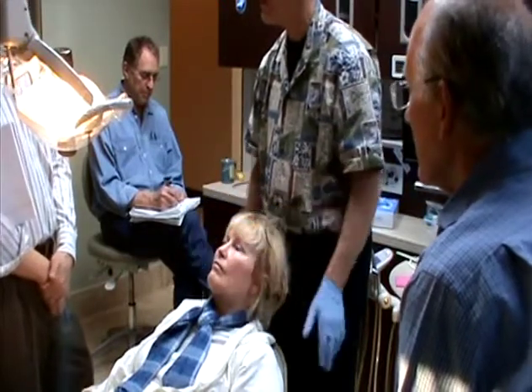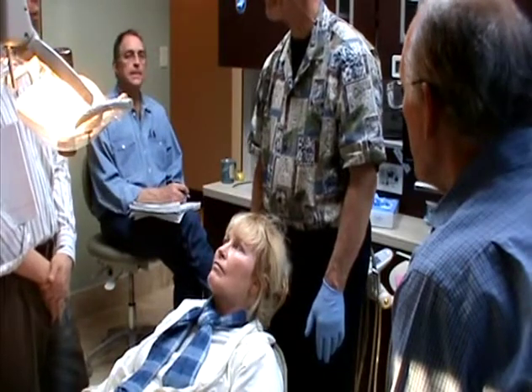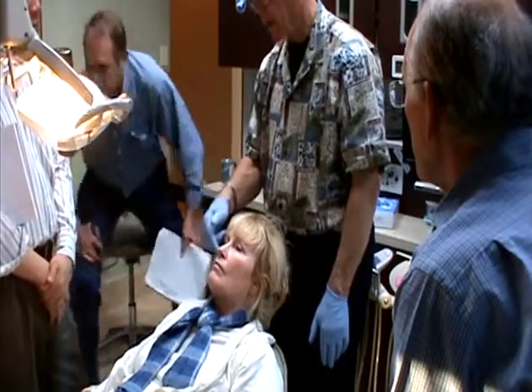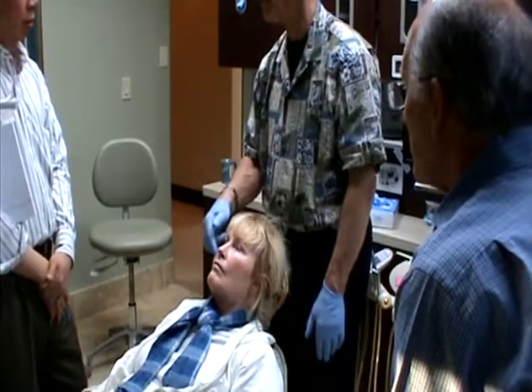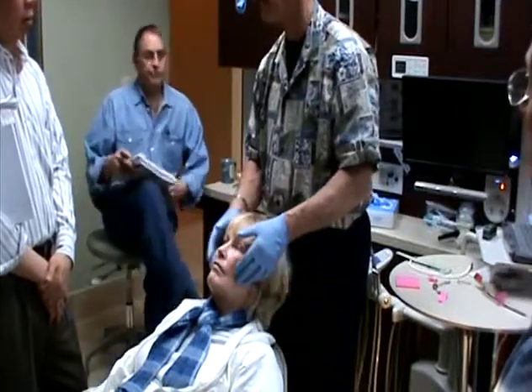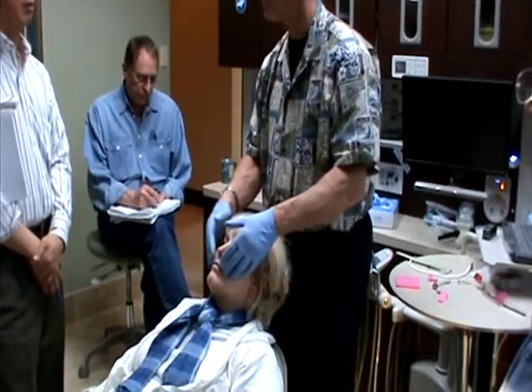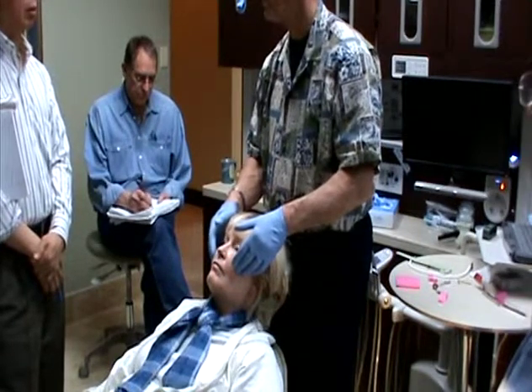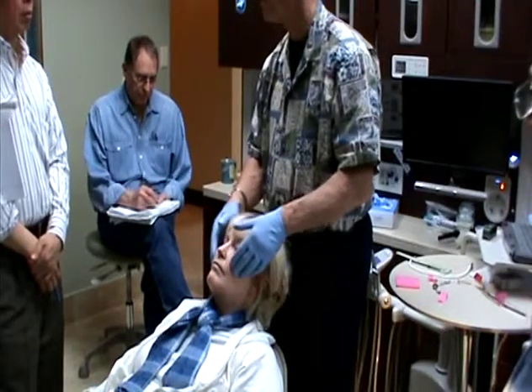But in patients, before you strap them up, do you have to suffer that consequence? If you're going to pivot the top off the lower to stabilize it, then you've got to do the top first, I believe, and then do the lower once you get the top where it belongs. And then put a wire in there and keep it out there, and then do the lower. Depends on how far you want it, where you want to expand the lower to meet the upper. You're going to need more expansion on the left than the right, probably on the lower, to keep up with the upper.